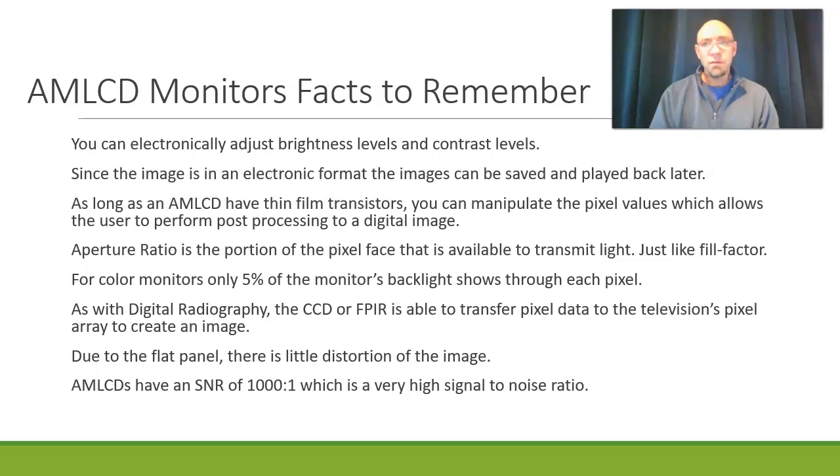And don't forget that we've got liquid crystal displays. We have different pixels, and those pixels represent different areas on the image intensifier. They represent different parts or different areas on the charge coupled device that is being used. And so we're seeing the image as it is seen by that CCD, which is really fascinating how that works. But because it's a digital image, we're able to manipulate it and make changes to it.